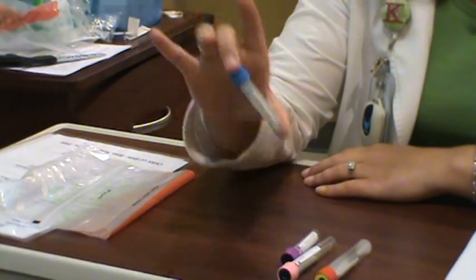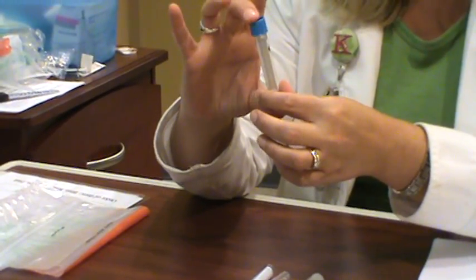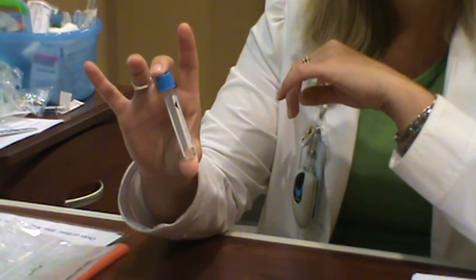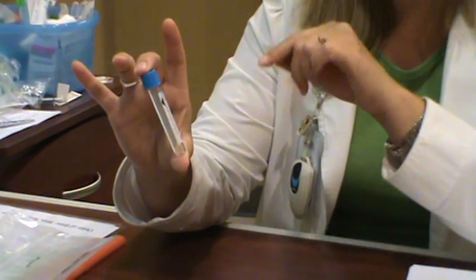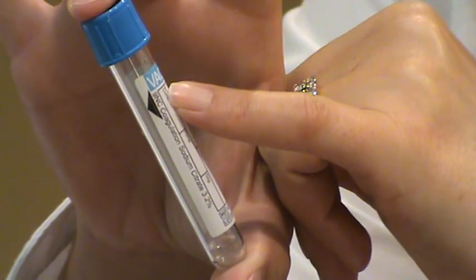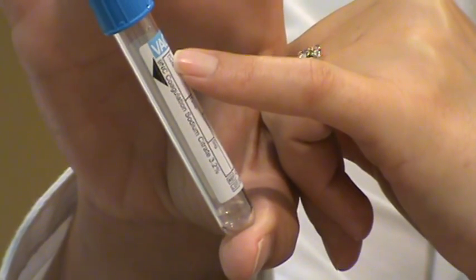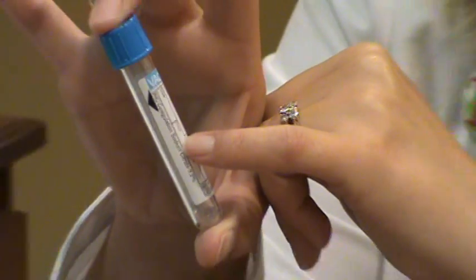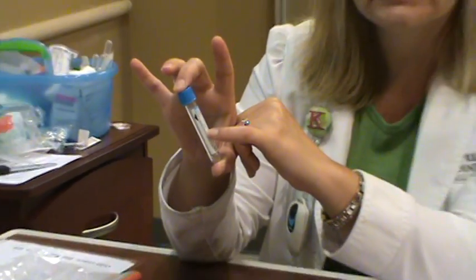The blue tube is the only one we're going to be really strict about. It actually contains a liquid anticoagulant, and we're looking for a specific blood-to-anticoagulant ratio. There's a large arrow on it, and we need it filled all the way. If you bring it to me half full, we're going to reject it and ask you to recollect it.